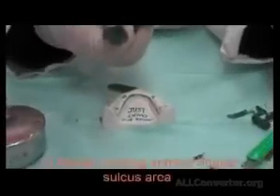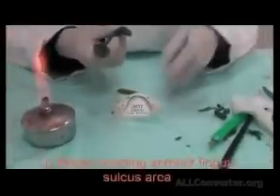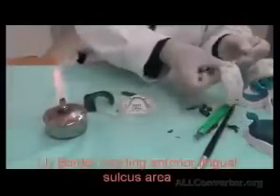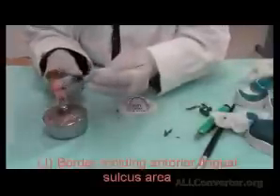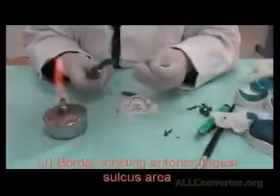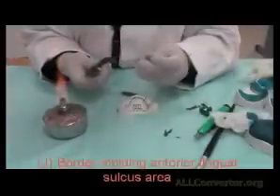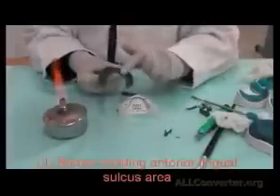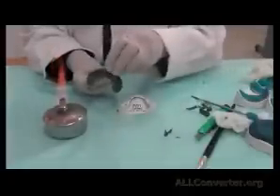More excess material. Removing the bulk of excess material on the sides would allow the excess material to flow away from the sulcus while under function. So this is the role of the impression all around. Now the lingual side, which is from 6 to 6.